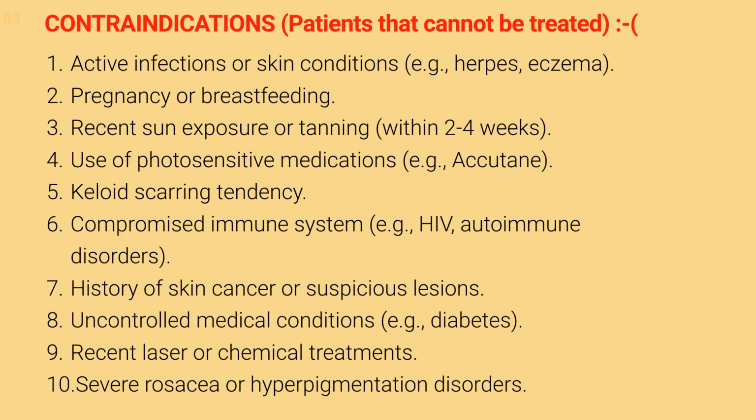Contraindications. Patients with herpes simplex, cold sores, bacterial, fungal, or viral infections in the treatment area are prohibited from receiving this treatment as it can trigger or cause an outbreak. Eczema, psoriasis, or dermatitis can worsen with laser treatment. Erbium laser treatments are typically avoided during pregnancy and breastfeeding due to the lack of studies on safety during these periods. Patients with recent sunburns, tanning, natural or artificial, or sun exposure within the past 2-4 weeks are at higher risk of complications like hyperpigmentation.